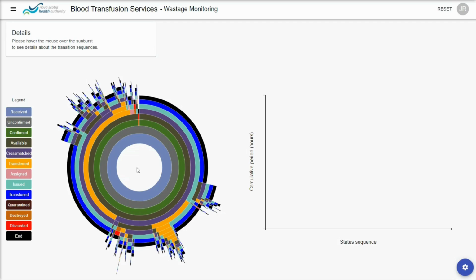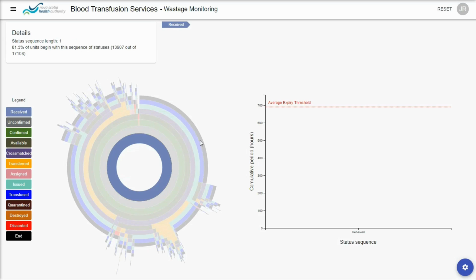The sweep angle of each segment shows the frequency of occurrence of the corresponding state, whereby in each level of the hierarchy the states are sorted in descending order clockwise based on the transaction state's frequency.